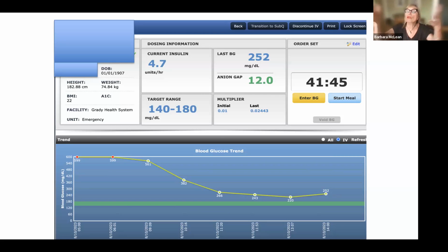I want to make sure you all appreciate that, because as long as your patient's at 599 or above, insulin will not get adjusted till every third blood glucose. You want to check on the progress of Glucommander, do a lab value, do comparative lab values, but they cannot be put into the Glucommander. The Glucommander is going to adjust slowly. And you can see that this is a nice, safe adjustment, getting our patient down towards their target.